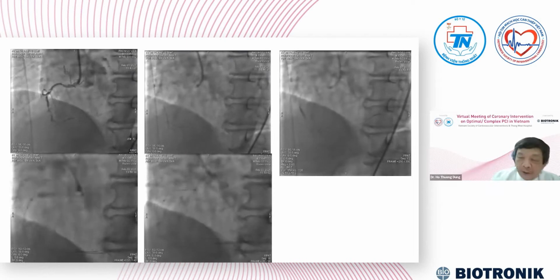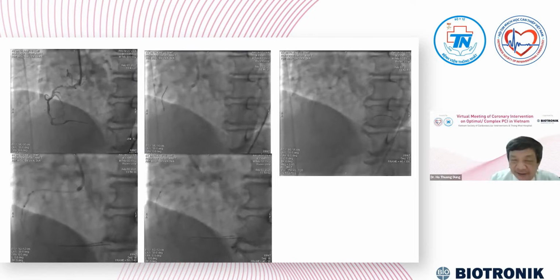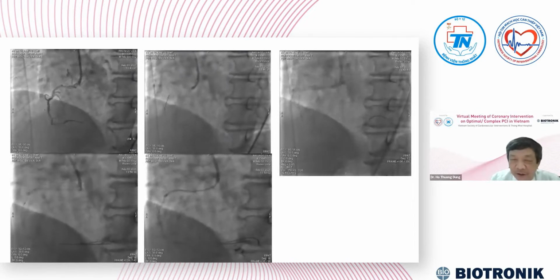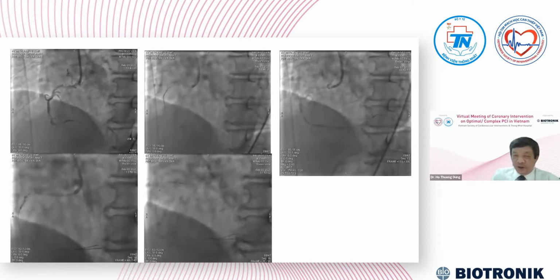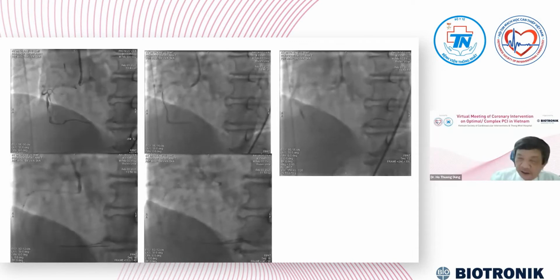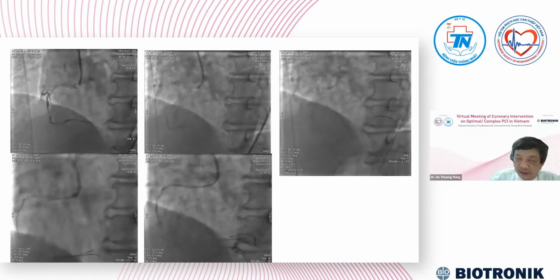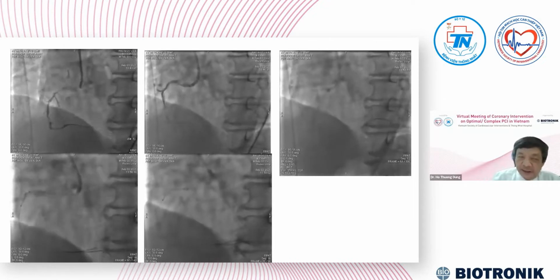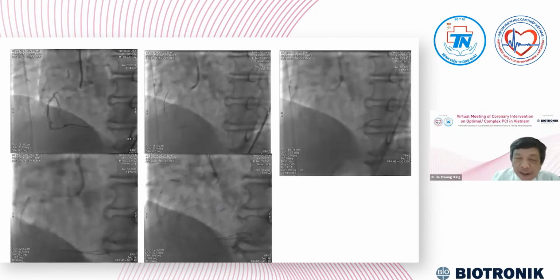And we try to bring the stent to the culprit lesion with the Zilla, but when the stent goes, it gets stuck in the proximal segment, because we see the lesion is not only the culprit lesion. In the second curve, there is one lesion in the first curve and one lesion in the mid, and the third lesion is the culprit lesion. So what can we do?